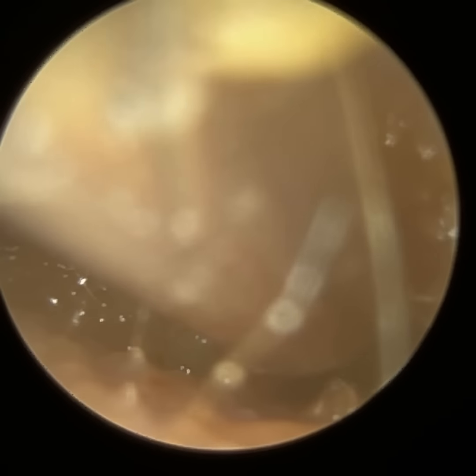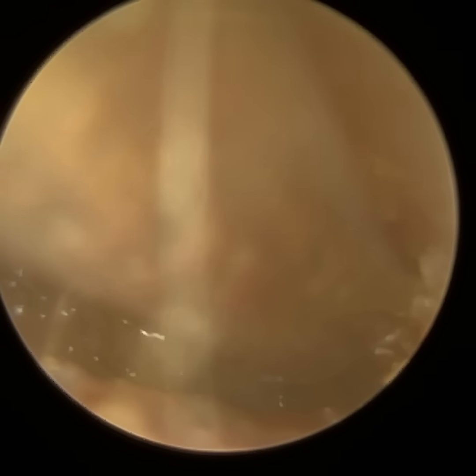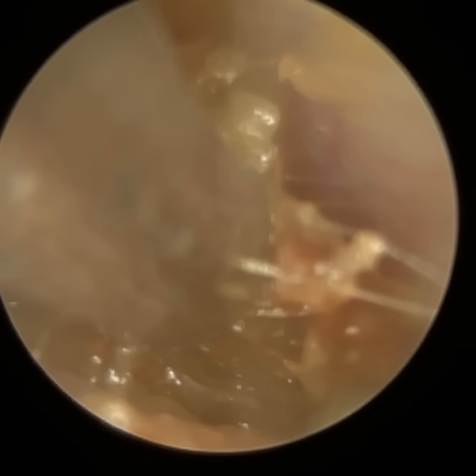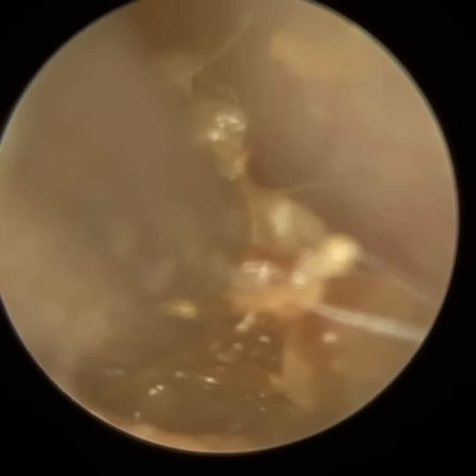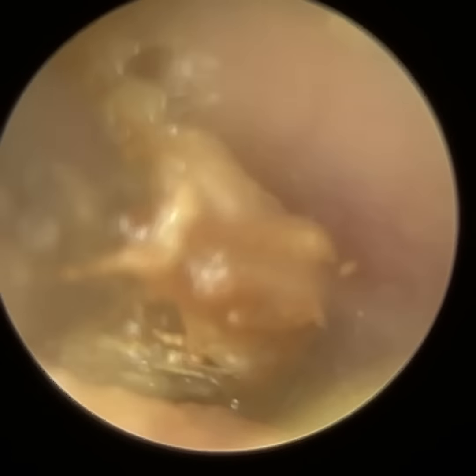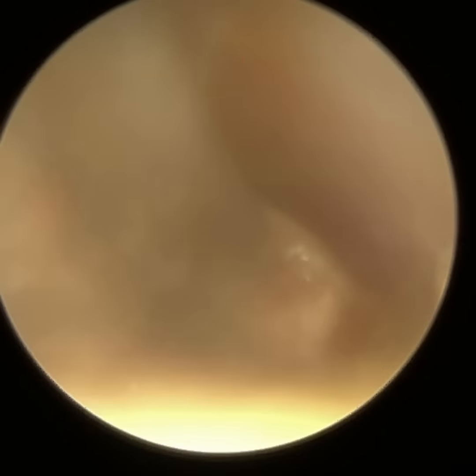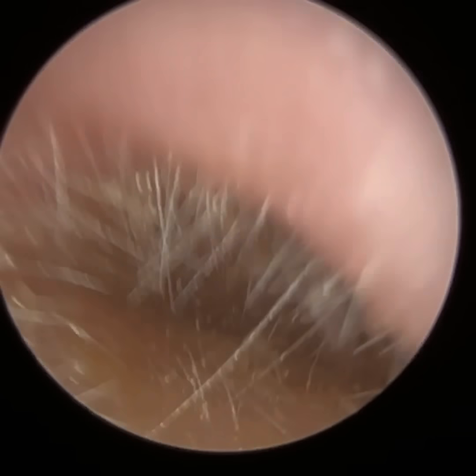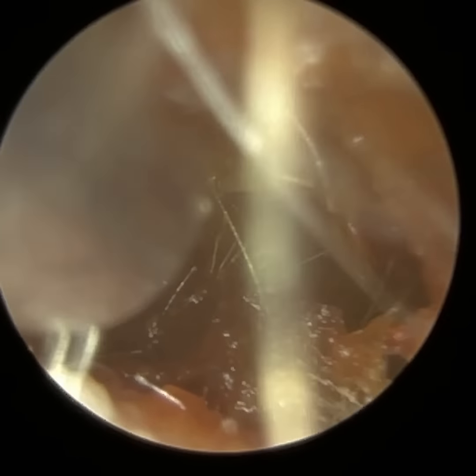And with granulation tissue, it has its own blood supply, so it undergoes a process of neovascularization where new blood capillaries are formed within the inflammatory tissue, and so you quite often get bleeding with a grade 3, not because we've lacerated the ear canal, it's just because as you're removing the granulation tissue, which is in contact with the keratosis obturans, these new blood capillaries burst and you get bleeding. There was quite a lot of bleeding actually in the grade 3 case.